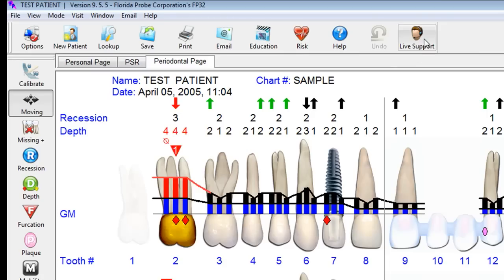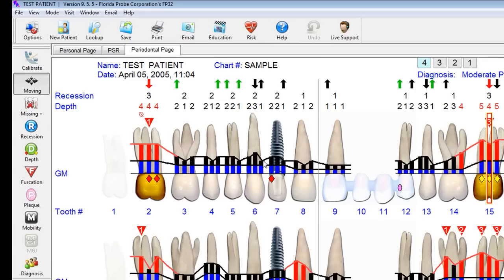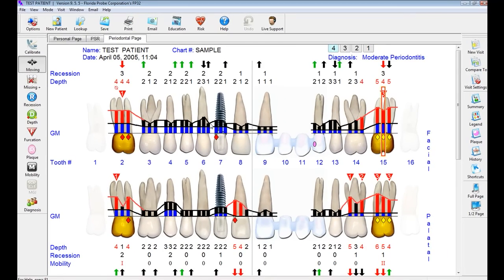We have a new feature called live support. Monday to Friday, Eastern Standard Time, you can click on this button and get live support directly through the software — an exciting new feature. Thanks again for taking the time on this overview tour of the new Florida Probe software.